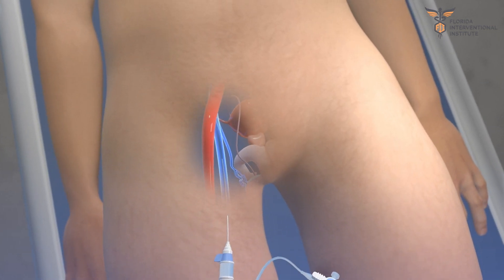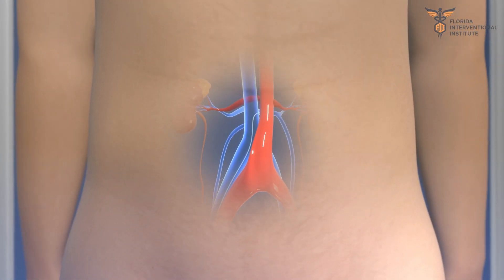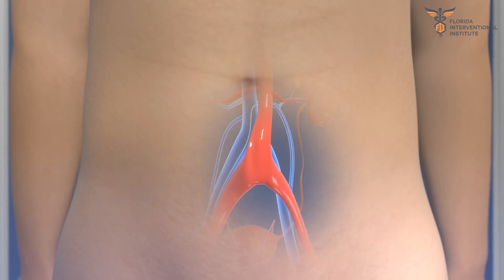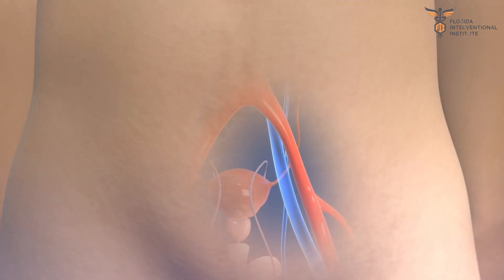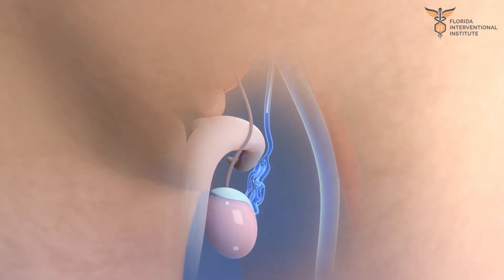This catheter is then carefully directed into the gonadal vein by your doctor using the guidance from x-rays. The catheter is then further guided down in the gonadal vein towards the testicle.